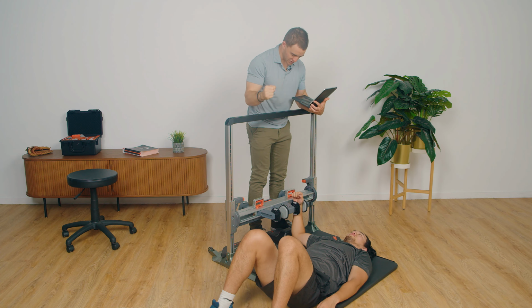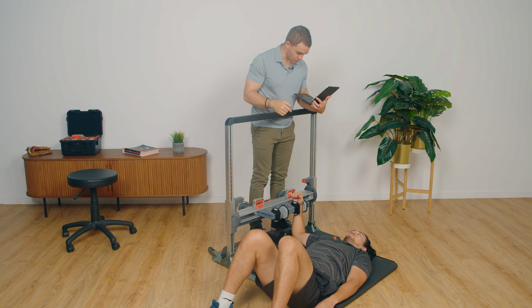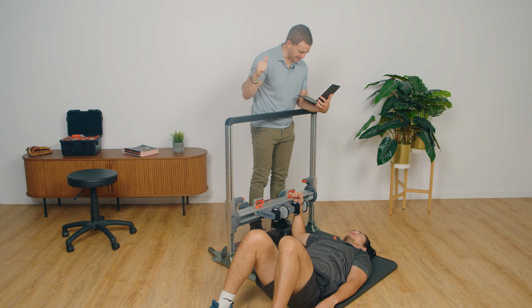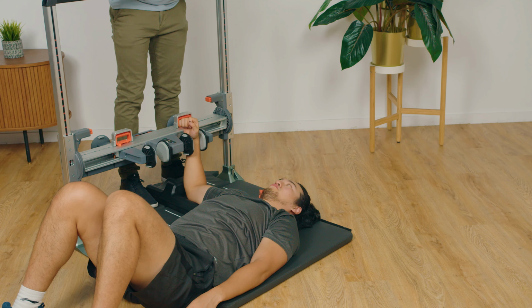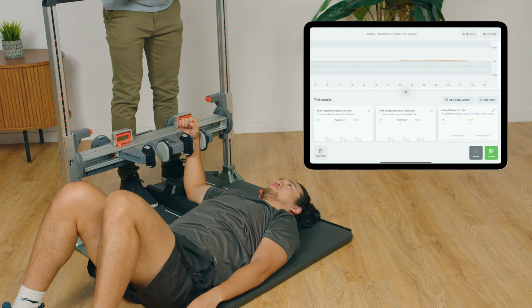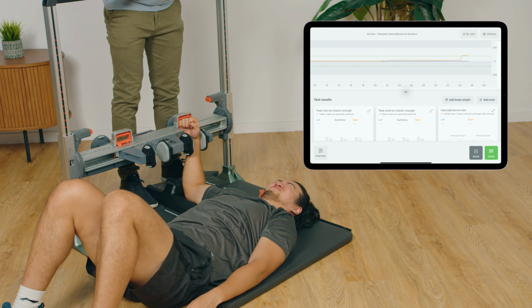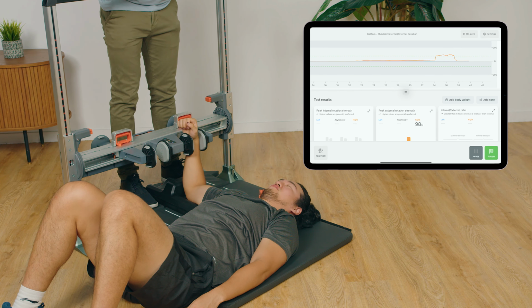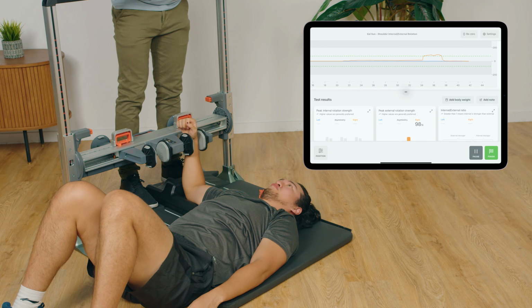So Cal, go ahead and place your hand in contact with the upper pad for external rotation. I'm going to say 3, 2, 1, go. When I say go, you build up force pushing as hard as you can and then you'll relax on my cue. All right? And 3, 2, 1, go. Push, push, push, and relax. Good. Nice. You develop force pretty quickly. If you'd like, you can build it up gradually over time, all right?